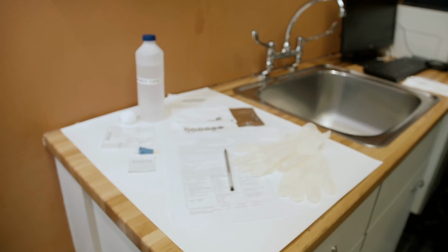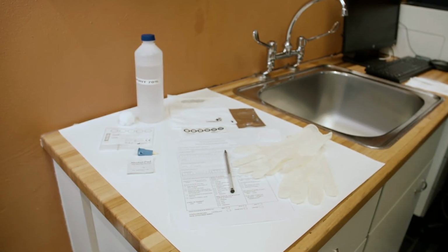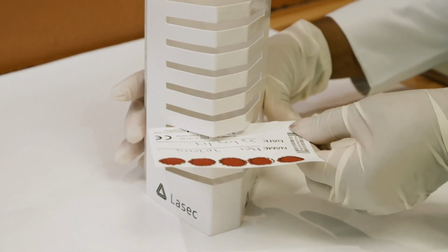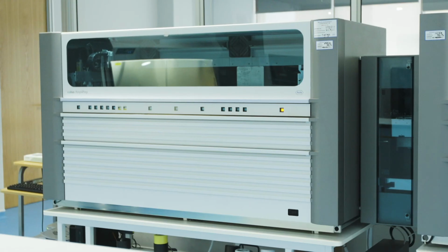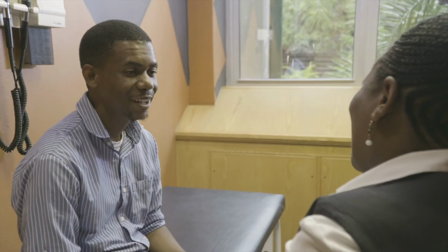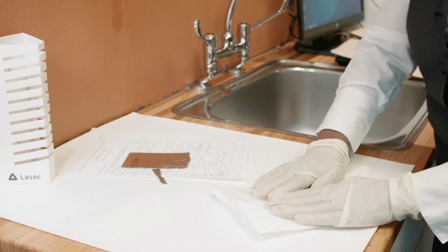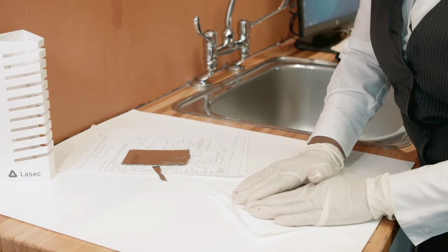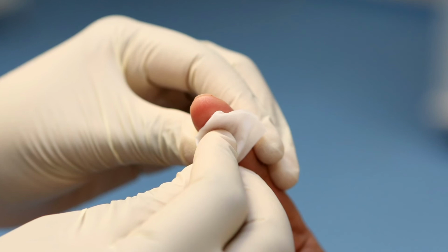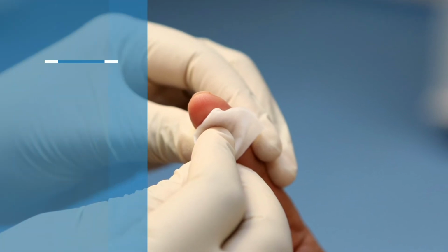Let's take a moment to review the information we've covered so far. We have discussed the materials necessary for collecting DBS, and we have provided instructions in handling and drying specimens and preparing them to be sent to laboratories. Hopefully, you are already feeling well equipped for your role in collecting DBS specimens for viral load monitoring. Besides collecting and handling specimens properly, you need to prevent problems to make sure each test result is as accurate as possible. Here are a few pointers.